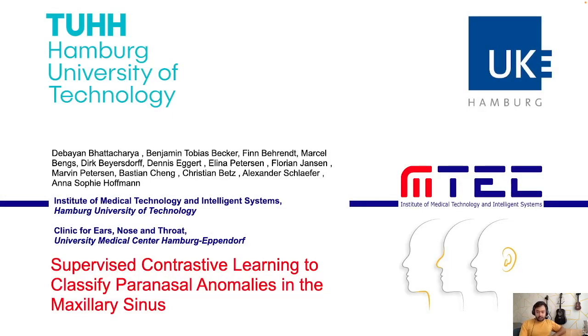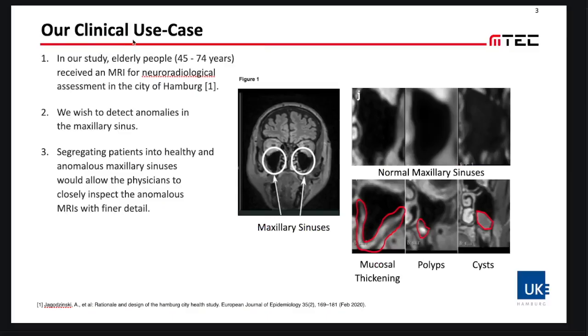In this presentation, I am presenting our work, Supervised Contrastive Learning to classify paranasal anomalies in the maxillary sinus. Now coming to our clinical use case. In our study termed the Hamburg City Health Study, elderly people in the age group of 45 to 74 years received MRI for neuroradiological assessment. As a first step towards automating the study, we detect anomalies in the maxillary sinus.